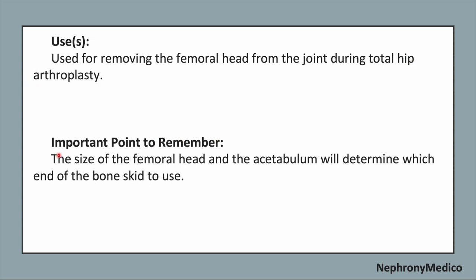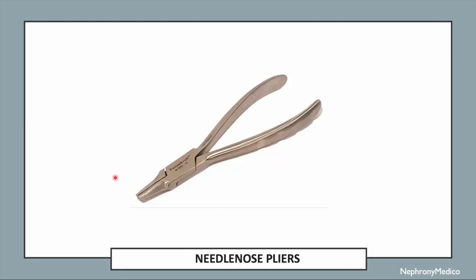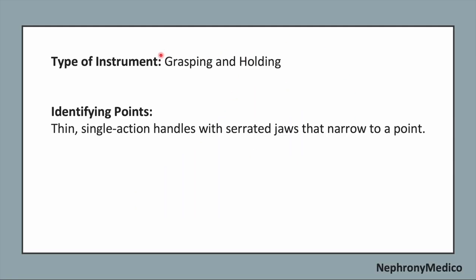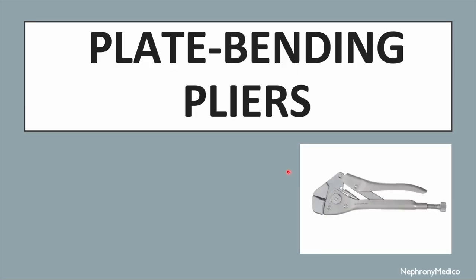Important point to remember. The size of the femoral head and the acetabulum will determine which end of the bone skid to be used. Let's talk about needle nose pliers. This is a picture showing needle nose pliers. It is a grasping and holding type of instrument. Identifying points. The thin single action handles with serrated jaws that narrow to a point. Use. Remove pins and hardware and twist wires.